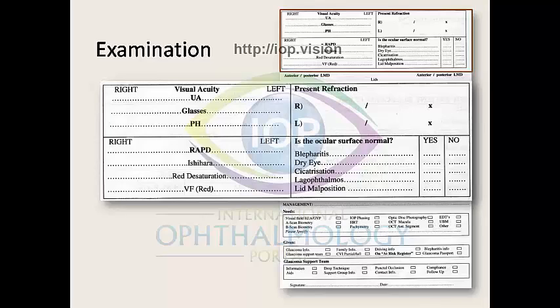I noticed you like to get an unaided visual acuity, and that can be important, especially if I'm doing refractive surgery. You want to know what their unaided visual acuity is like, and oftentimes they have a very high refractive error. Obviously their unaided visual acuity is terrible, especially if they're -5 myopes, they're not going to be seeing anything on the chart really. I suppose that's not as important for glaucoma patients, what their unaided acuity is.